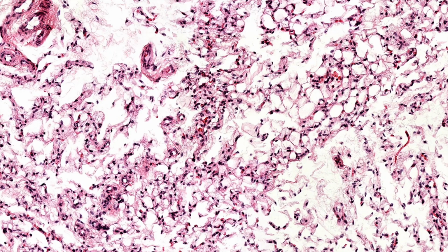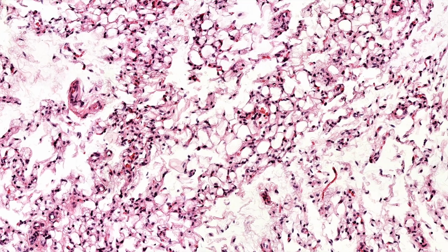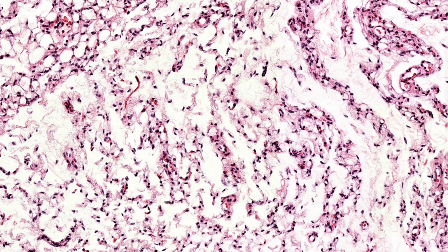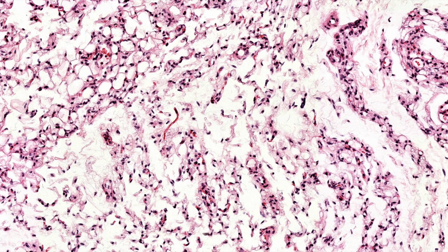In fact, for anyone who has seen a myxoid liposarcoma before, the little tiny chicken wire vessels of myxoid liposarcoma, which is vanishingly rare in the skin and is usually in deep soft tissue, so kind of outside the scope of what we're talking about, the vessels in that tumor look a lot like these vessels, and that's because that tumor is recapitulating embryonic fat, and these kind of vessels are always present in fat.